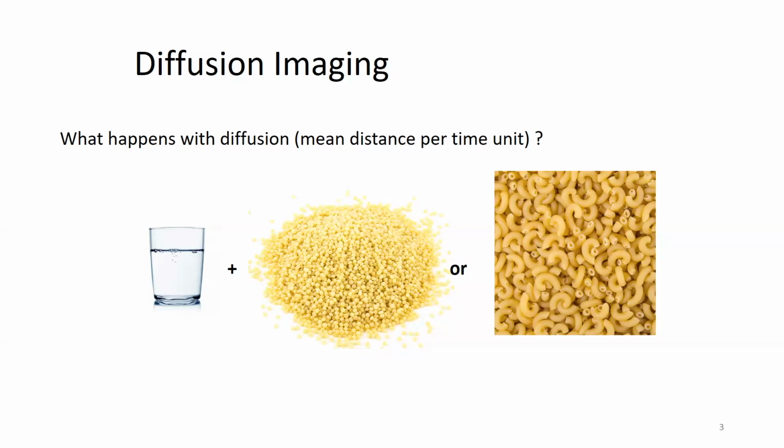And why? Yeah, but it's mainly because they have barriers. So the water molecules are still water molecules, but the water molecules may want to travel, say, 3 or 4 steps. But now, there's a couscous molecule. So there are membranes or barriers which hinder the diffusion of the water molecules.